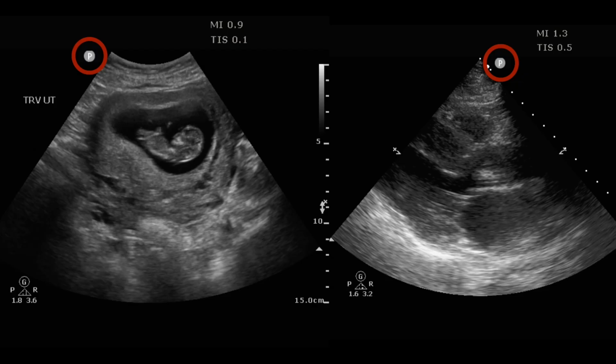The first thing that I think we really need to get into is the conventions that we're going to use as we use our machines. I was thinking about this on the way in today, and part of me wanted to have some fun with this part and talk about the medical version of multiverse theory, and how cardiology and radiology exist in two different universes when it comes to echo and orientations, and how we in emergency medicine have to be this third universe and take the best of it. It was kind of cool, but it was going to take too much time. So, all joking aside, cardiology has a very different convention from radiology for how they do ultrasound.